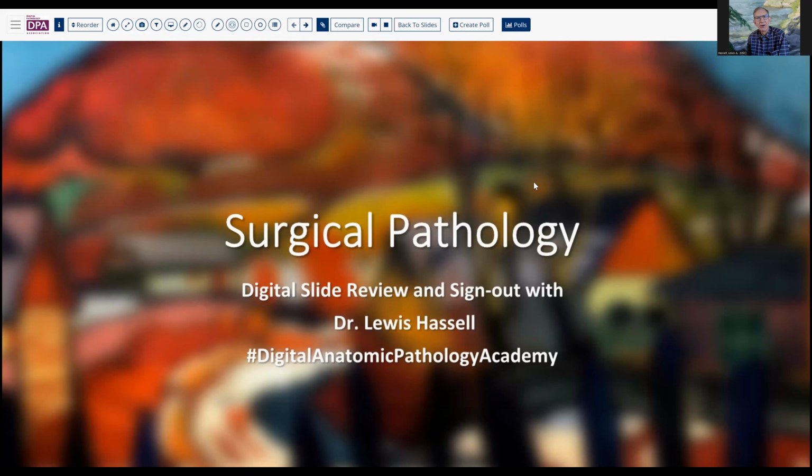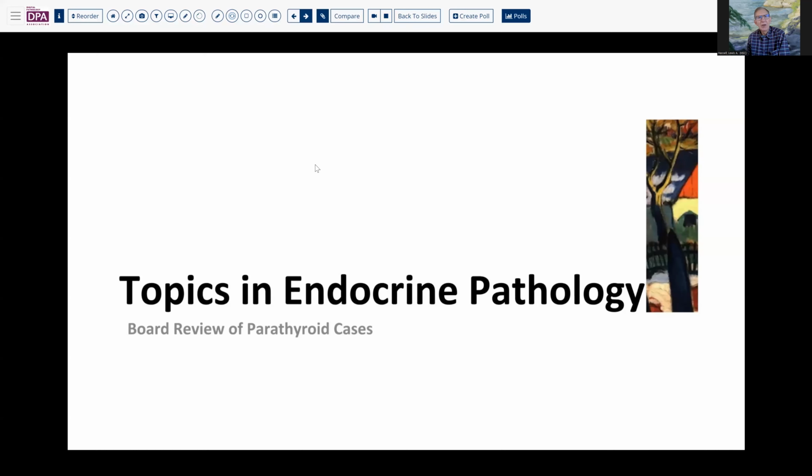Now, while usually we talk about individual cases, today we're going to take a slightly different approach and talk more about a particular topic, an organ, and utilize the resources of the Path Presenter and Digital Pathology Association site to help explain these concepts. We're going to talk about parathyroid disease and specifically prepare you with just about everything you might need to successfully pass any questions the boards could throw at you on parathyroid disorders.